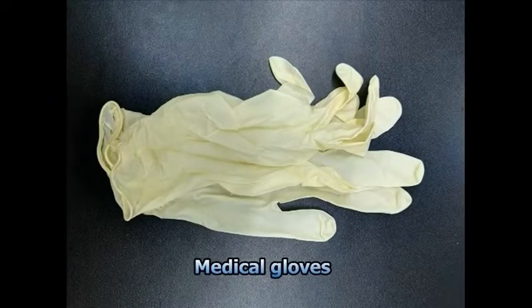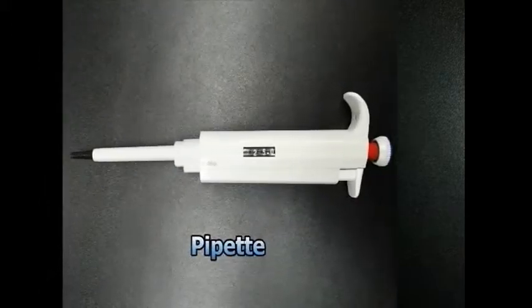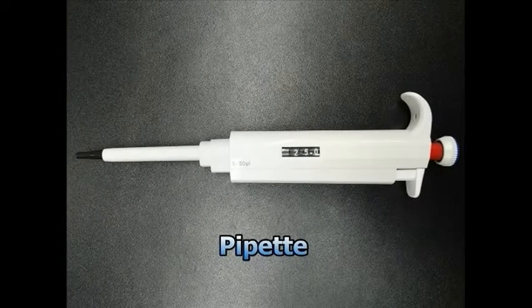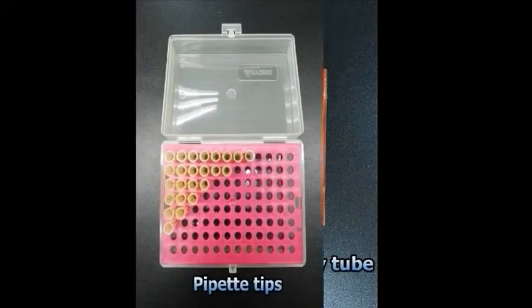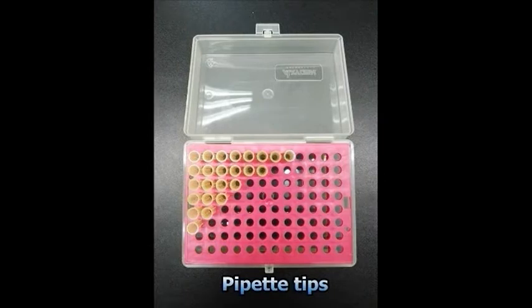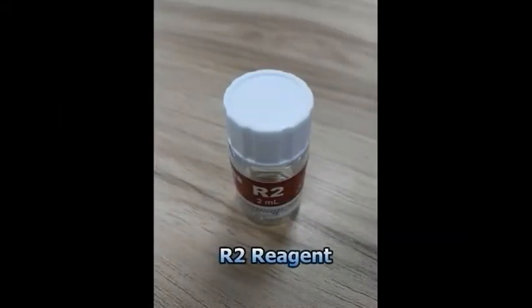Medical gloves, timer for fast test mode, pipette adjusted to 25µL, 5µL glass capillary tube, pipette tips, 200µL general specifications R1 reagent cartridge, and R2 reagent.